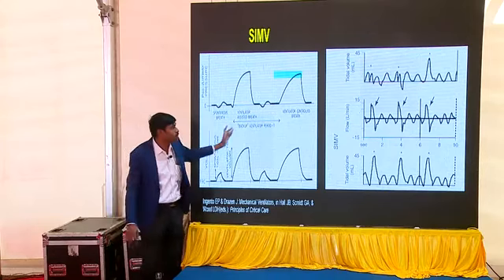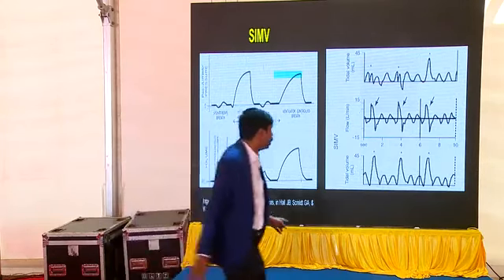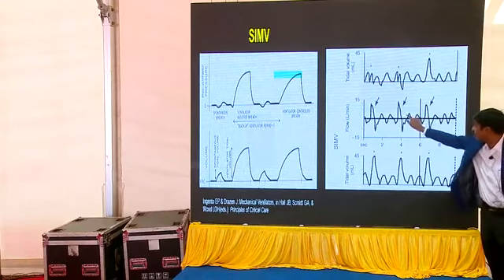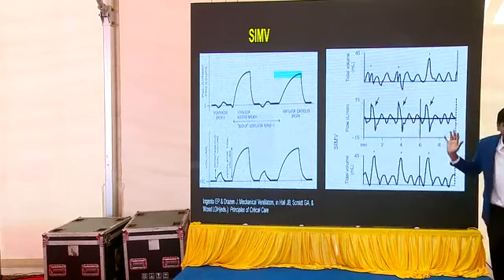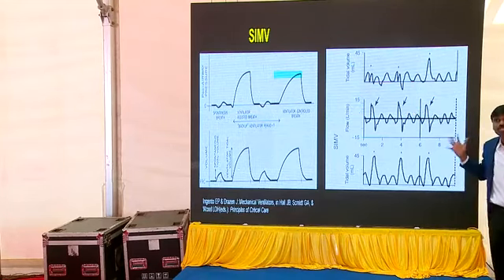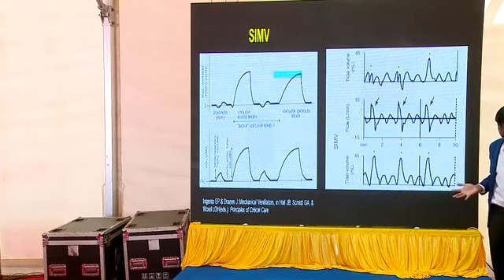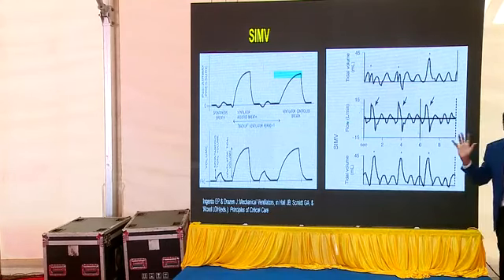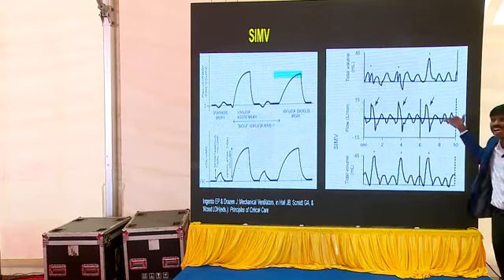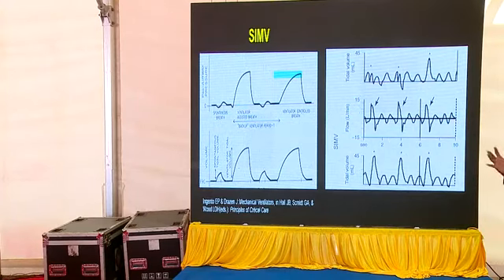But what happens is, now as you see here, the in between breaths here. So these are all the machine is assisting, whereas these in between breaths are not supported. So what happens here, the pressure delivered as well as the volume which we are achieving is not optimal. Whereas if I'm telling the baby, I need 40 breaths in SIMV, it gives 40 good breaths. But if the baby breathes 60, the remaining 20 will be the baby's own efforts, which may not be that great and not that optimal. So that's about SIMV.